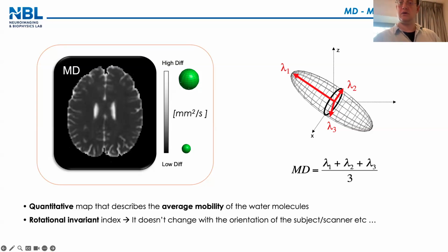Yeah. I think I'm a bit confused. Maybe it's just stupid. No, go ahead. So DWI is our acquisition, and then there is ADC. I don't really understand the relationship with mean diffusivity. What is the difference between mean diffusivity and ADC? I'm coming to that. Okay.